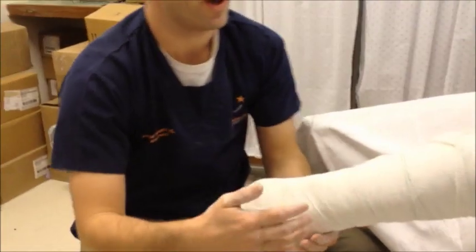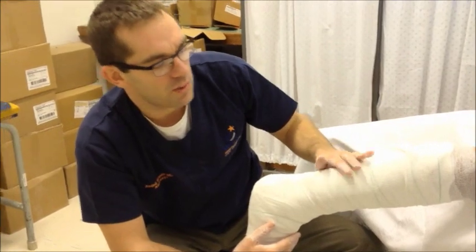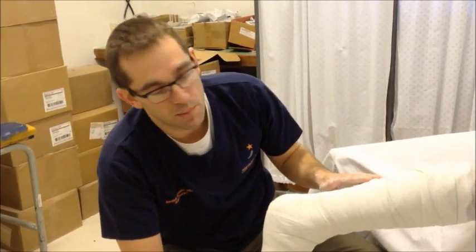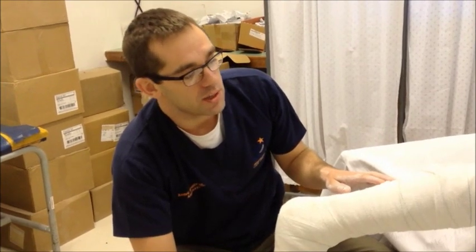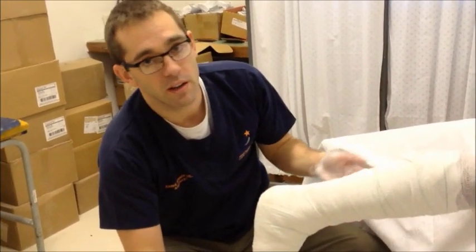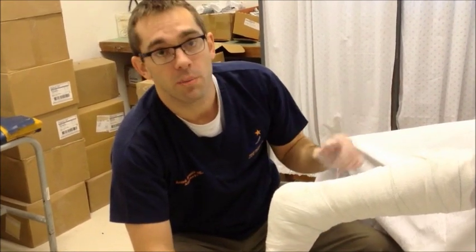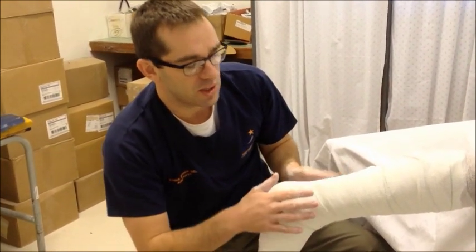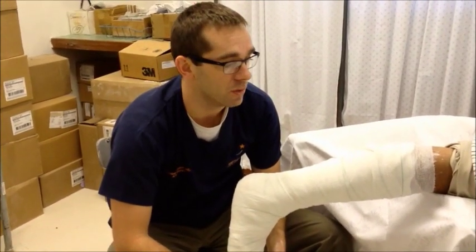The positioning of the patient is quite specific because we're having his leg hang over. This is something we have to do often because we are staff limited and resource limited — you don't always have the luxury of an assistant to hold the plaster for you. So here gravity becomes your assistant. Obviously this is something you can't do in someone who's got multiple injuries or is unstable — it's just a nice little cheat to be able to do everything nicely with one person working.